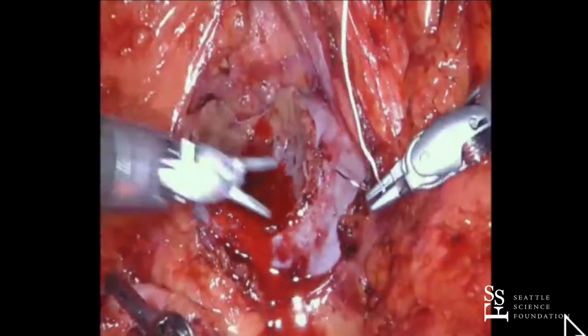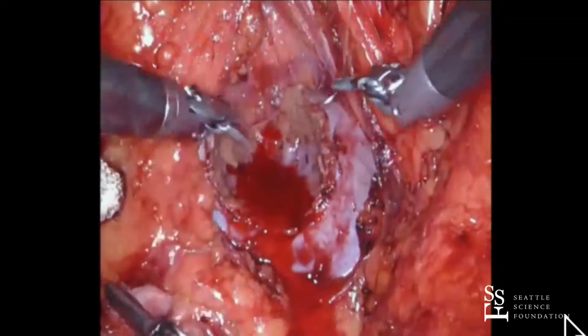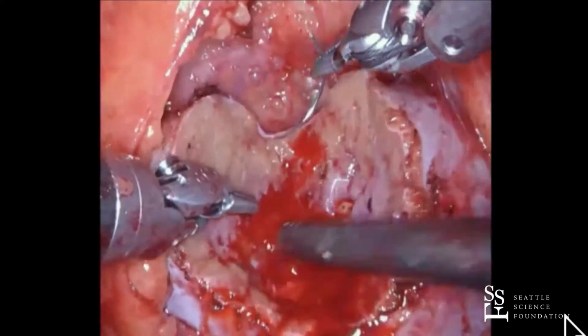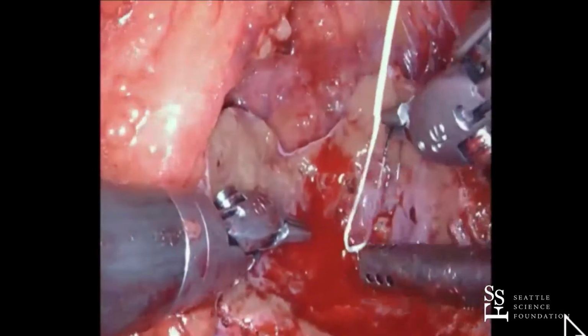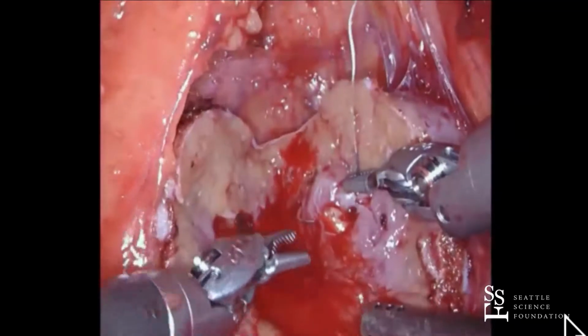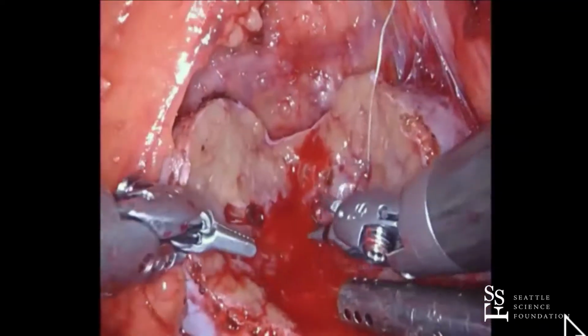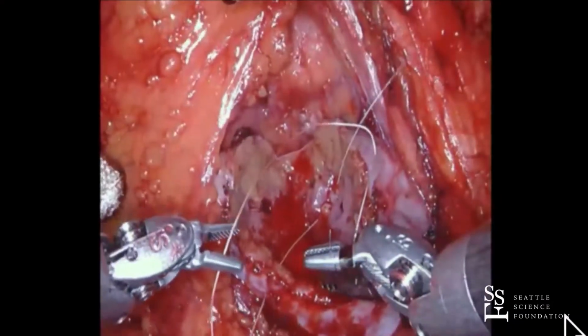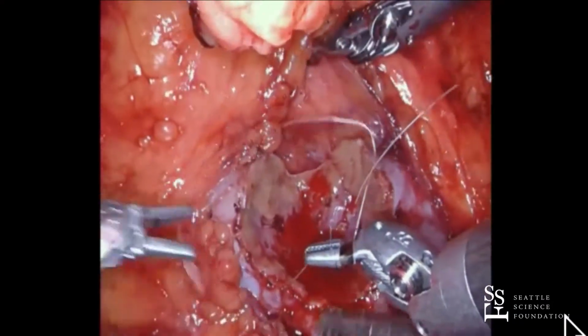All right, so I'm going to do my normal look for vessels. Go ahead, Brando. So we've got a vessel right here with a sinus. Fourth arm. All right, let me just come off a little bit. Is that better?